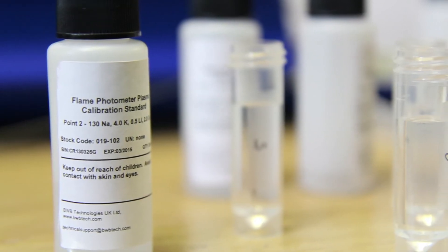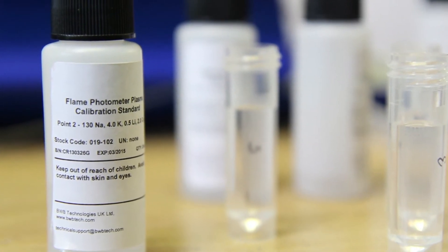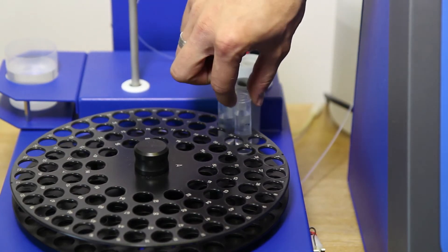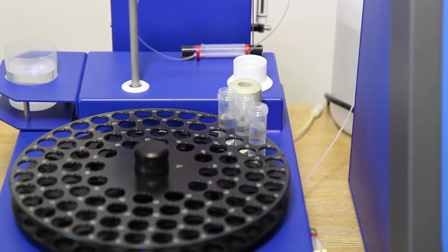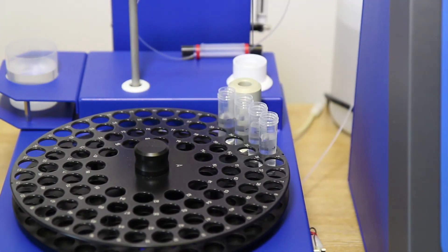A tray of calibration standards is prepared using the solutions provided. Calibration points 1 to 5 are placed at positions 1 to 5 in the carousel, with the extra solution provided for lithium and calcium placed at position 6.